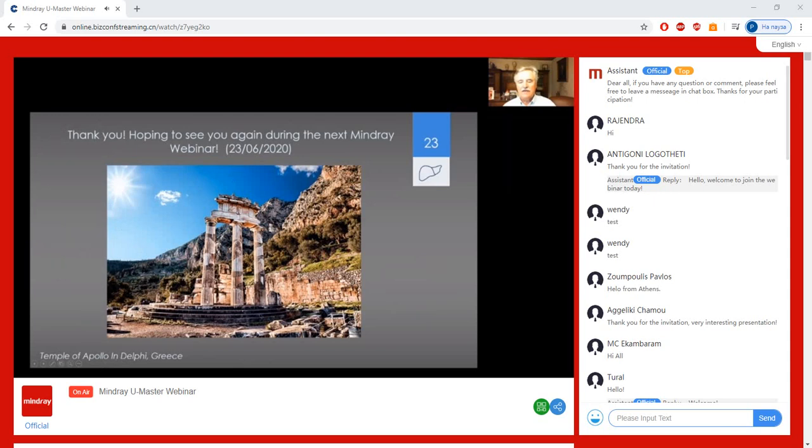Only 3 columns are remaining like that. Imagine that the whole thing represents the possibilities of ultrasound. We have already 3: B mode for morphology, color Doppler for hemodynamics, and elastography for stiffness and fibrosis measurements.